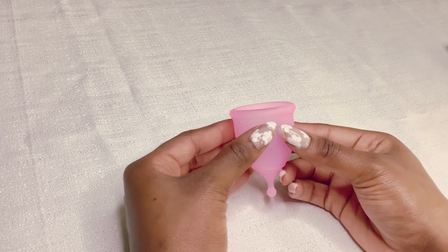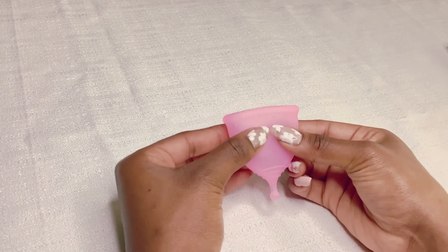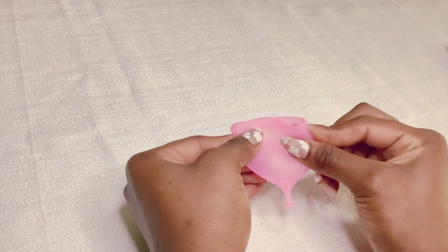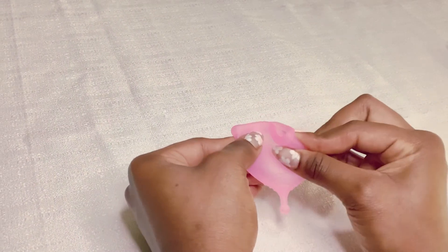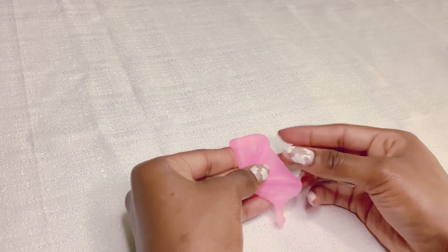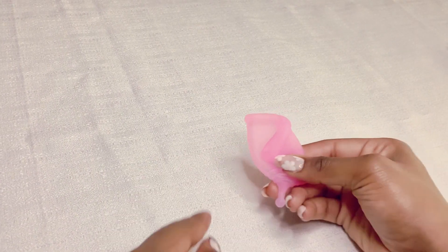Next, we have the sevenfold. We recommend using the sevenfold if the previous three didn't work. To do the sevenfold, you take the cup, squeeze it, then fold it over to create a seven shape. To get this fold to pop open, you can push on the fold that you created, which would be at the bottom of the seven.